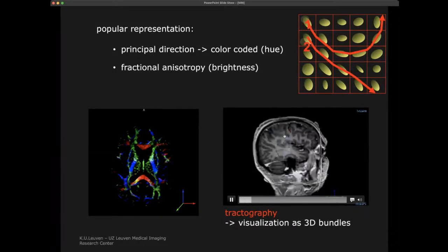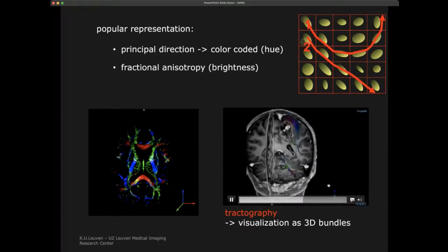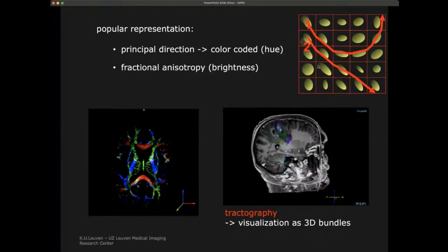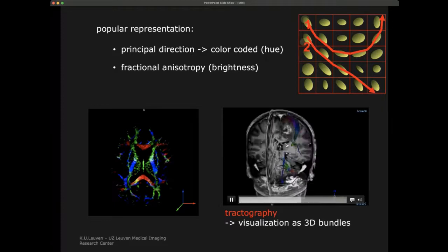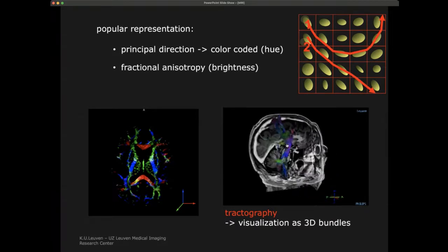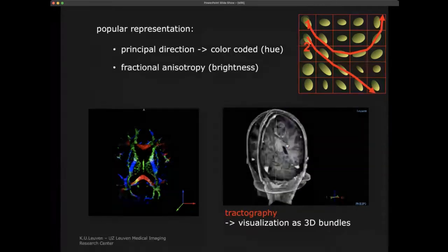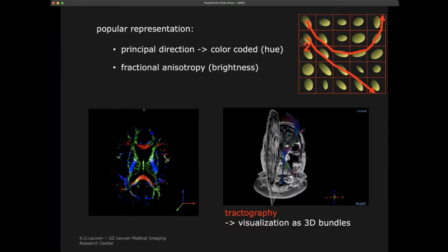And then, for example, we can do fiber tracking. By following these directions, we assume that within a fiber we have a continuum of diffusion directions. This way we can make tractograms, which show the direction of the fibers of the axons within the brain, and so you can look at connectivity of the brain. There are a lot of studies showing that the amount of connectivity, the distance of connectivity, and so on are related to different abnormalities of the brain, for example.